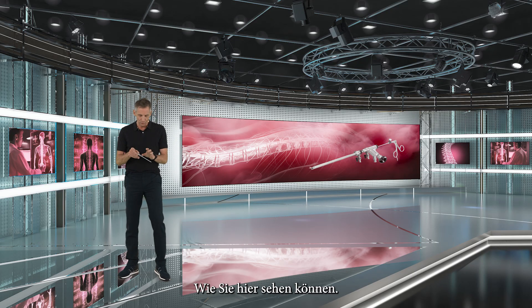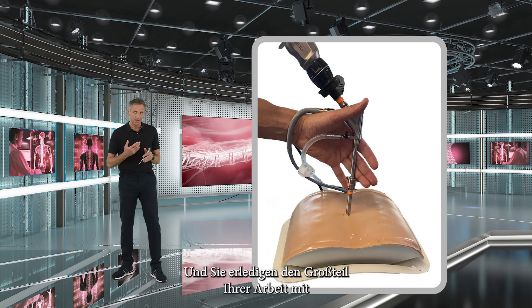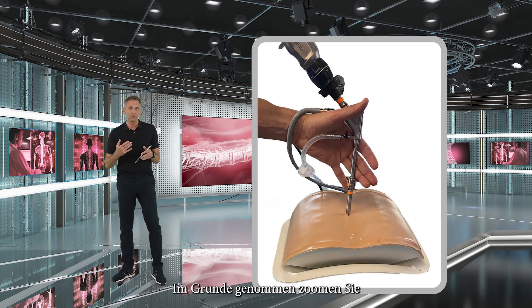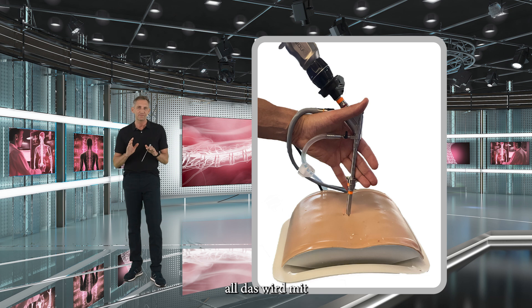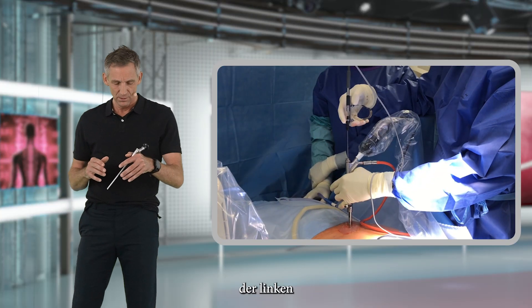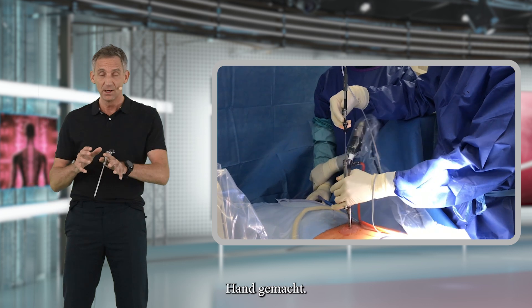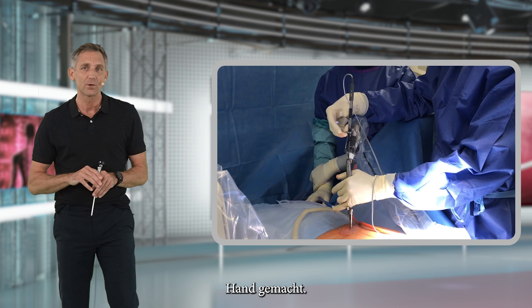The endoscope is resting on your hand, as you can see here. As a right-handed person, you are holding your scope with your left hand, and you're basically doing the majority of all your work with your left hand, which is something you need to get used to in the beginning. So basically you zoom in, you zoom out, you look cranially, you look caudally — all of this is done with your left hand.